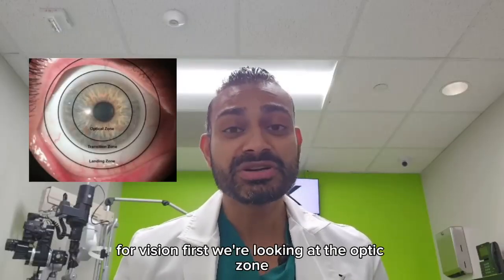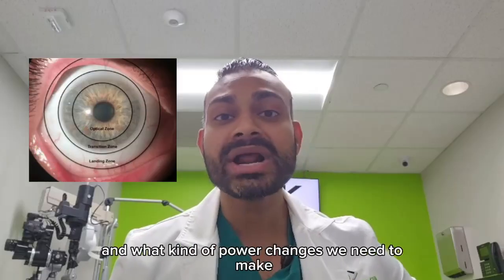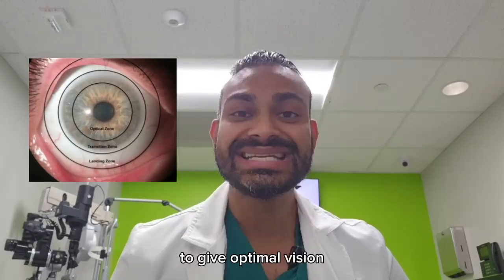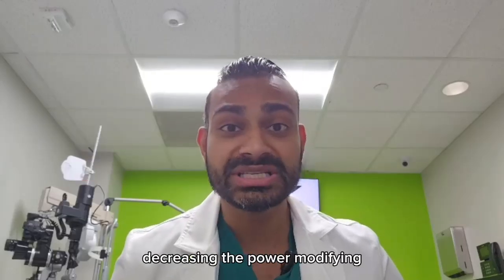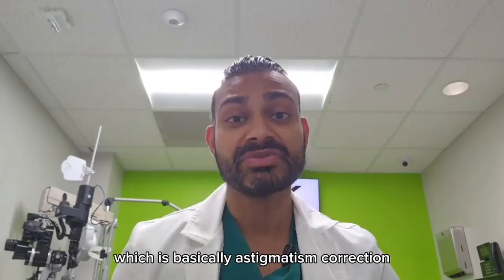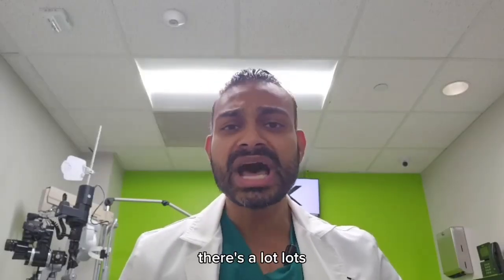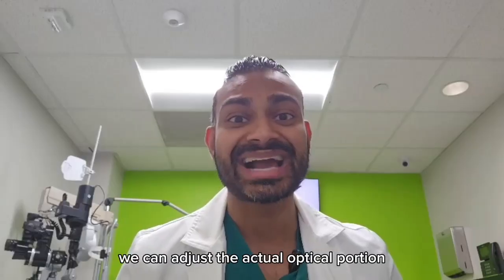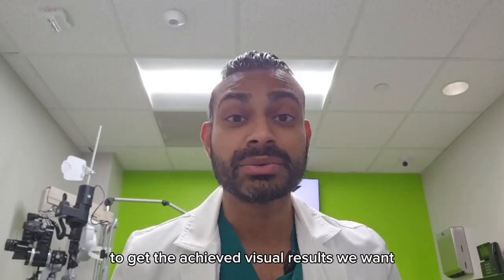So for vision, first we're looking at the optic zone, what diameter that is on the surface of the lens, and what kind of power changes we need to make to give optimal vision. So that could be increasing the power, decreasing the power, modifying and adding what's called front surface toricity, which is basically astigmatism correction onto the front part of the lens. So there's lots of different ways we can adjust the actual optical portion of the scleral lens to get the achieved visual results we want.